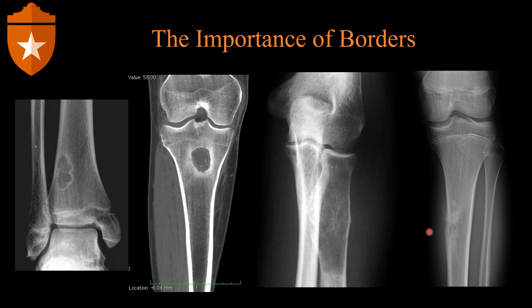The last image shows a lesion in the proximal tibial diaphysis from an aggressive tumor. You cannot trace a line around this lesion — you don't know where it begins or ends. This is called a wide zone of transition, and it tells us the lesion is very aggressive and vascular. Osteoclastic activity is moving forward across the bone unchecked; osteoblasts have been unable to define a border, stop the lesion, or produce any bone barrier. This is the most aggressive pattern.